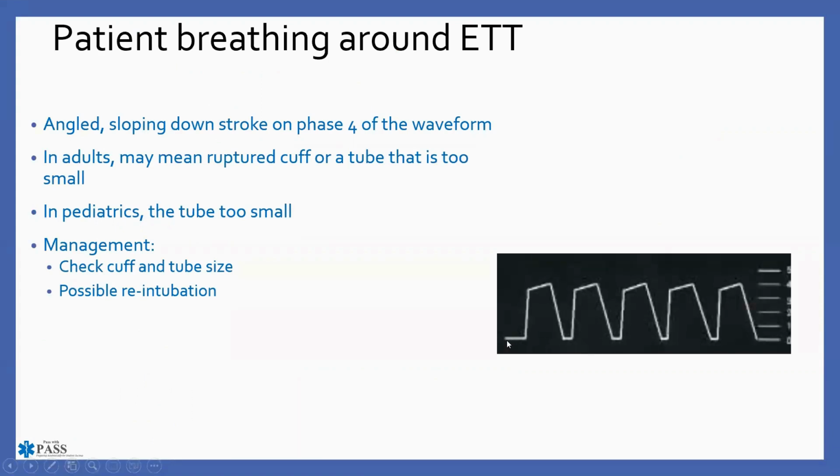So look, here's your respiratory baseline. Here is exhalation. Here's the plateau. The far right corner is my number. We'll call it 40 here. But now look at inhalation. When the patient inhales, it doesn't go straight back down to the baseline. It's actually taking time for that patient to inhale.